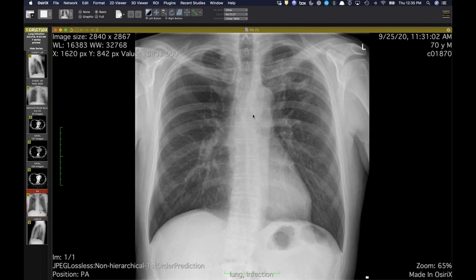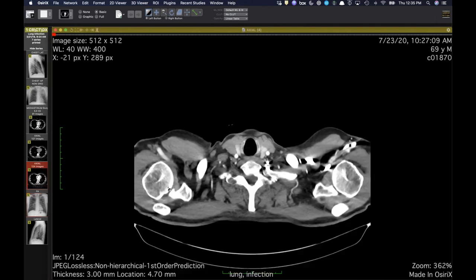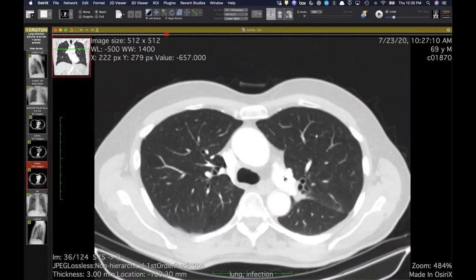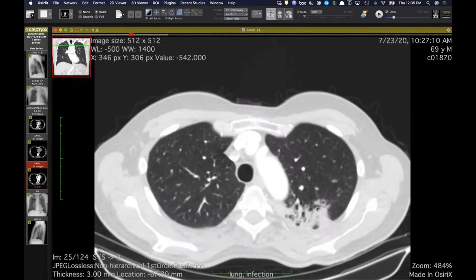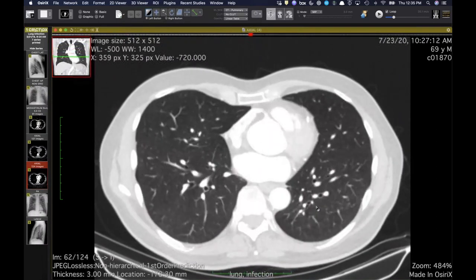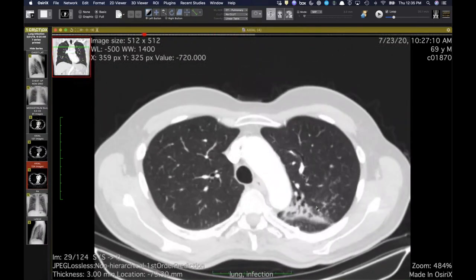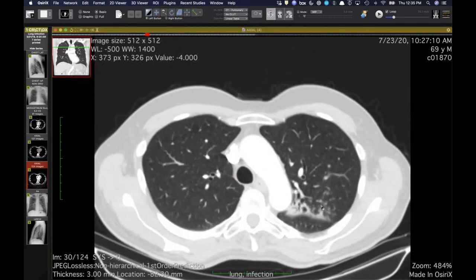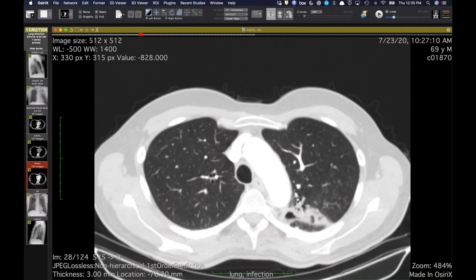So I first saw this and was worried that this patient might have tuberculosis. But going back, we were able to get these outside images and see that this is just the residua of his cocci pneumonia. And we see lots of patients like this where these things never fully resolve after cocci. It's interesting because it's different than histo, that these rarely calcify too. I don't know why, but that's another picture of cocci in this case.